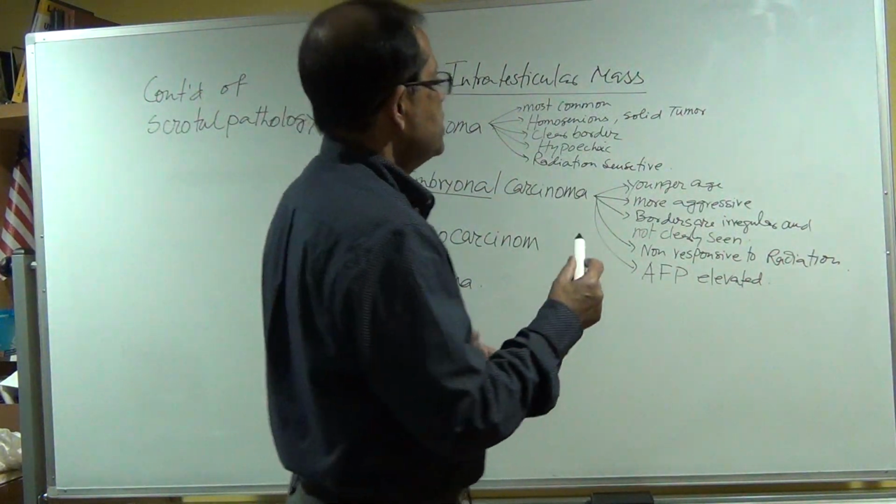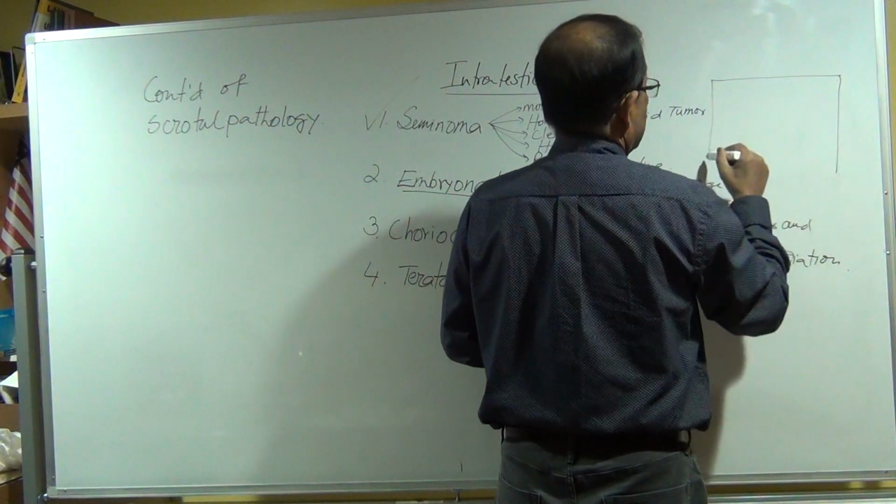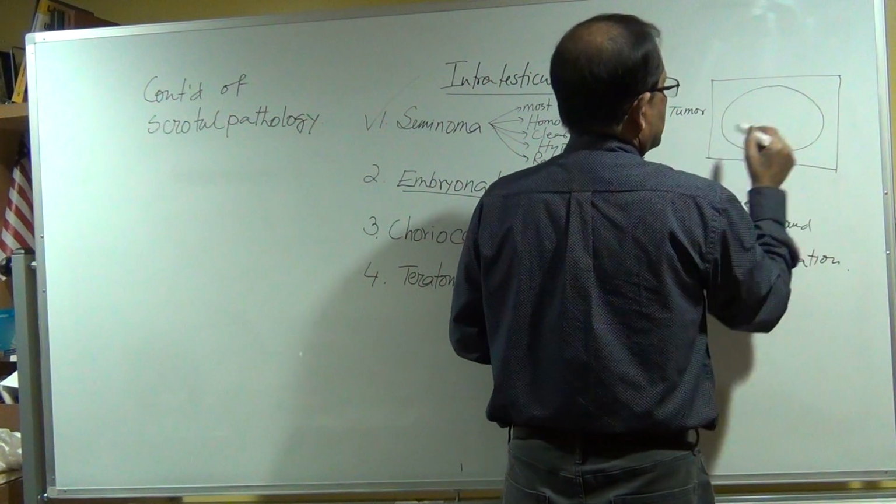Okay? The seminoma, if you want to see the seminoma, this is testis.